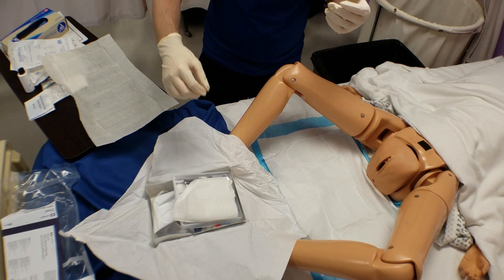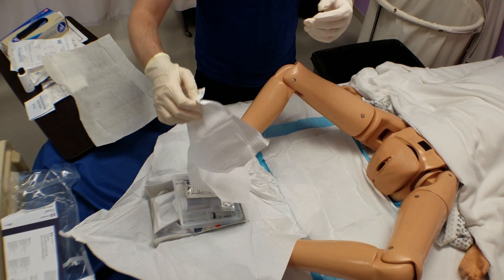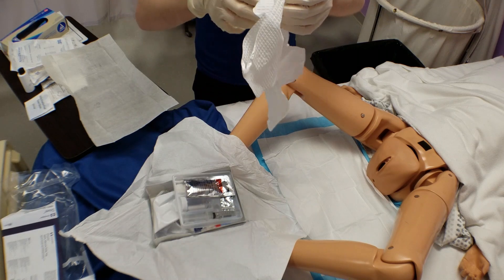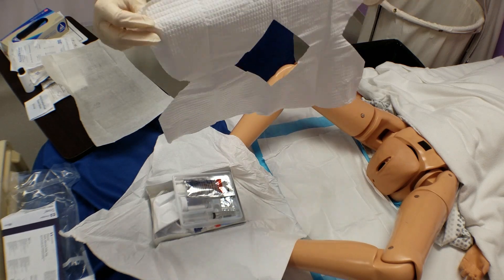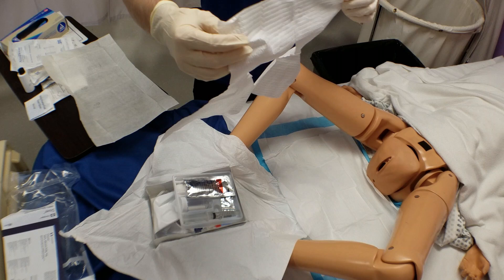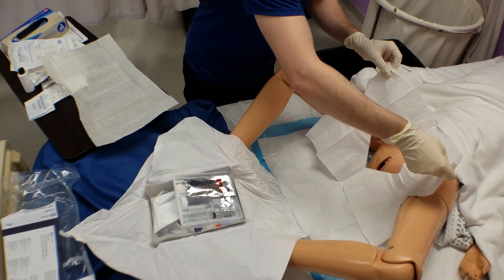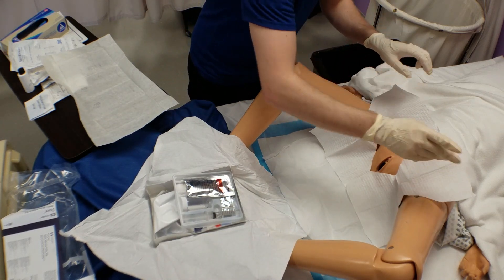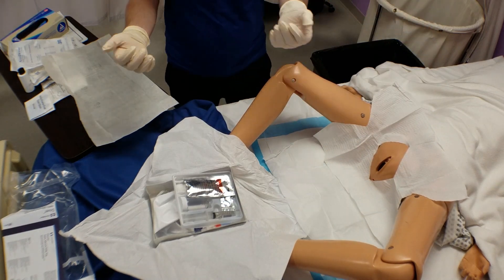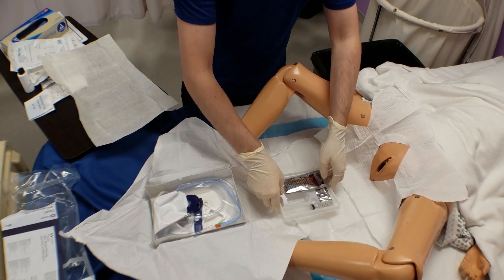With sterile gloves, you may now grab the fenestrated drape — the drape with a diamond-shaped hole in the middle. Carefully place this drape over the patient's perineum, exposing the perineal area. Do not contaminate your gloves by touching the patient or the bedding directly. You may now organize the rest of your supplies in your kit.